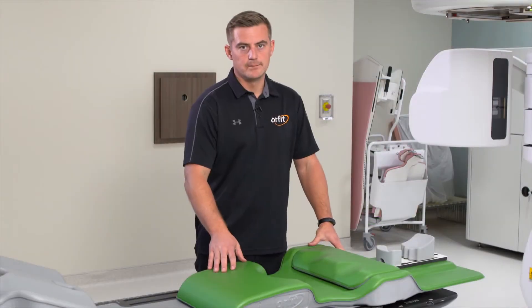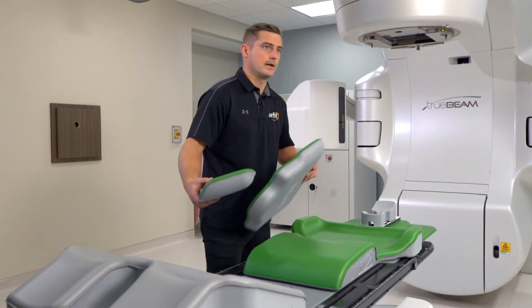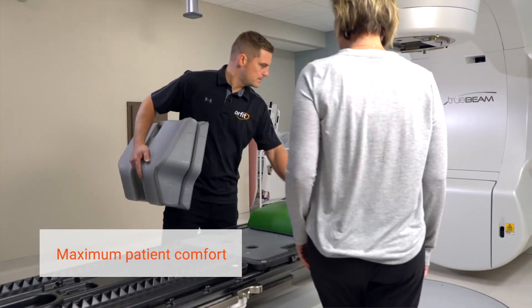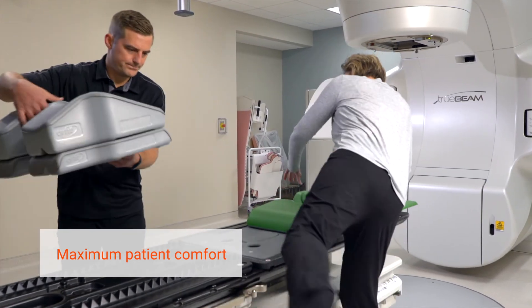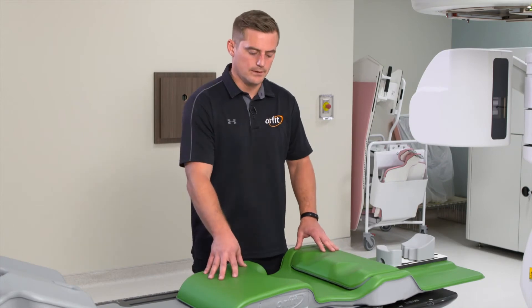When we designed the bellyboard, we kept a lot of things in mind. Ease of use — so it only has three pieces. Also patient comfort, as we know there are lots of pressure points when you're laying prone as a patient. We made those pressure points softer with different material than the actual board itself.